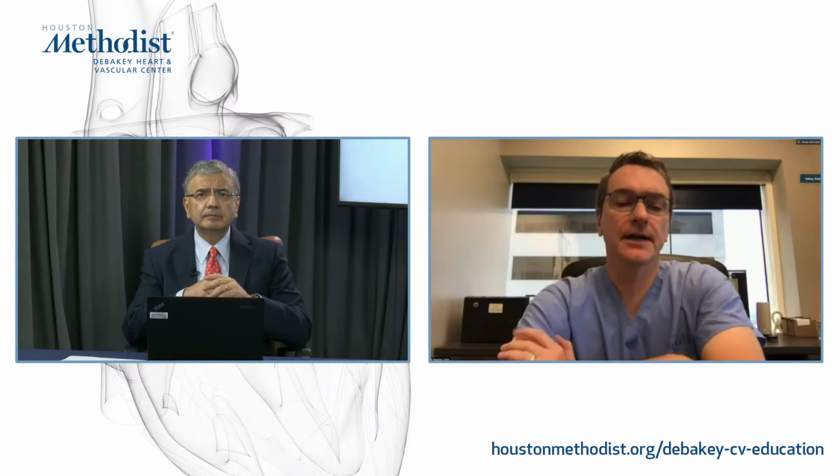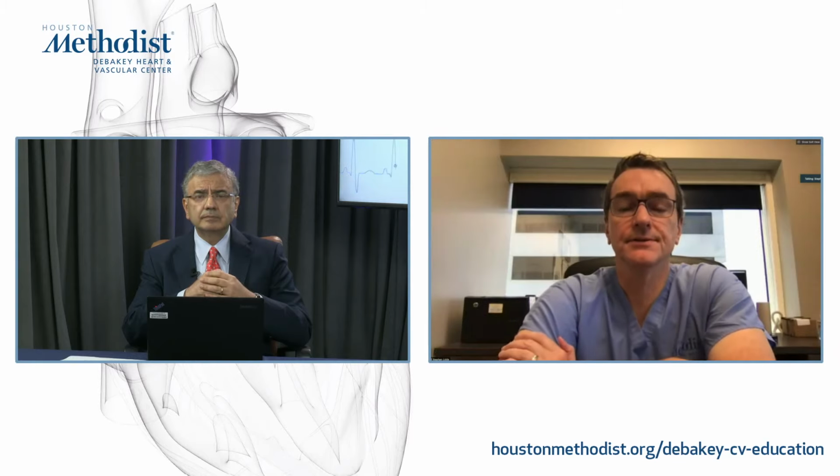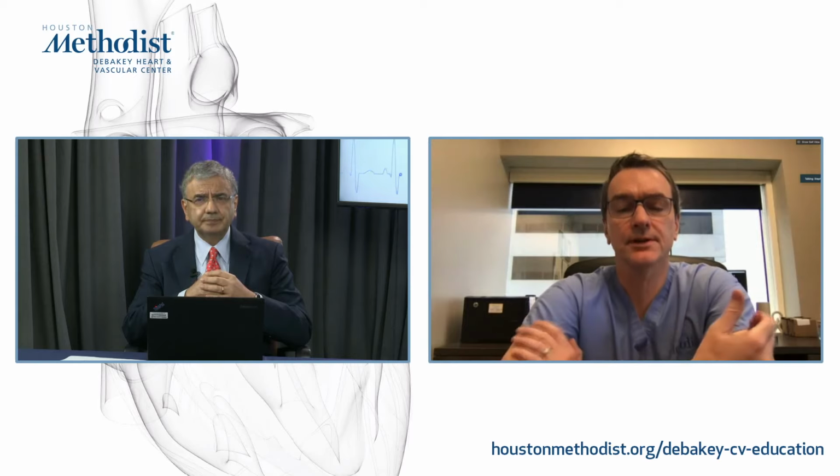No, I would completely agree. I think the application that seems best suited is still TR, where you have incomplete jets. Or if you're going to see an incomplete jet, that's where it is. You rarely see an incomplete aortic stenosis jet.